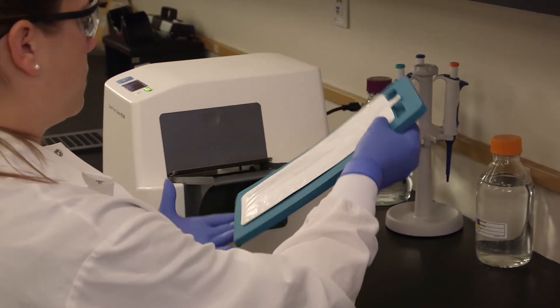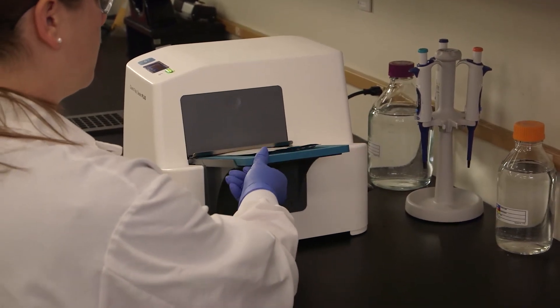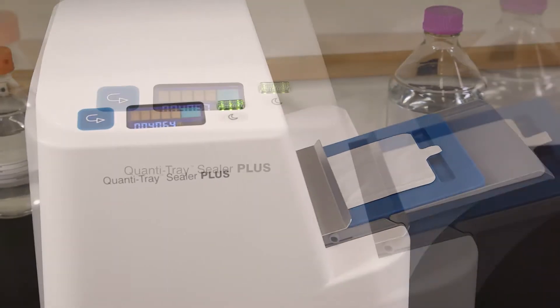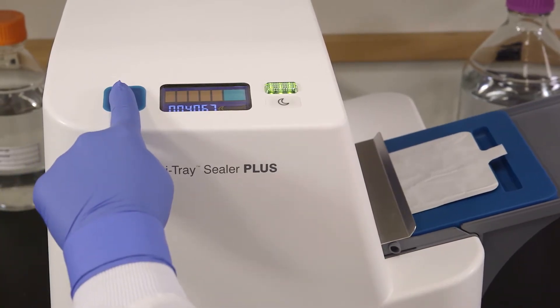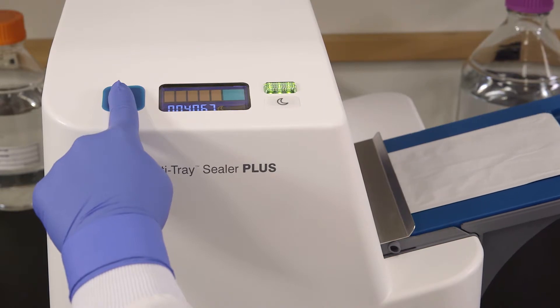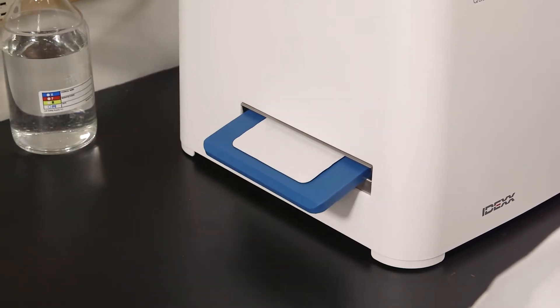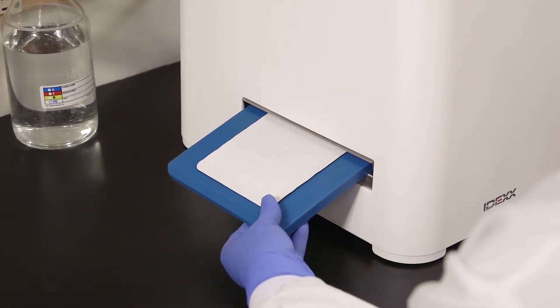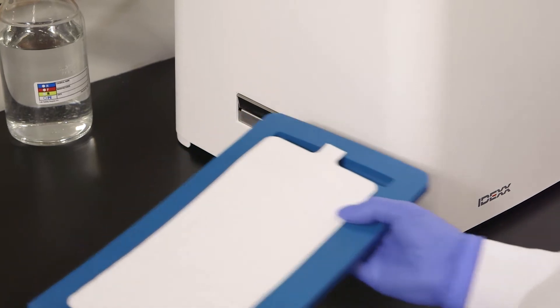Push the insert with tray into the sealer until the sealer grabs the tray and pulls it into the slot. If you need to reverse the motor, press and hold the reverse button. However, do not reverse the motor if the rubber insert is completely inside the sealer. The sealer distributes the sample mixture into the Quantitray wells, seals the wells, and partially ejects the sealed tray. Remove the rubber insert and tray from the sealer.